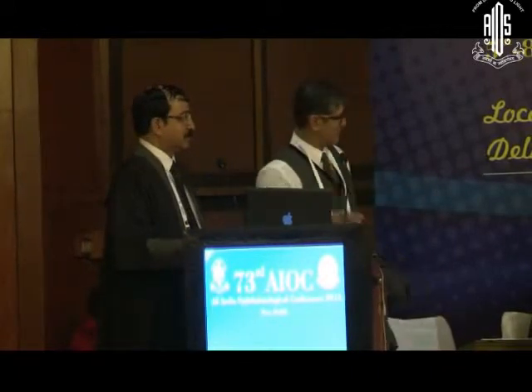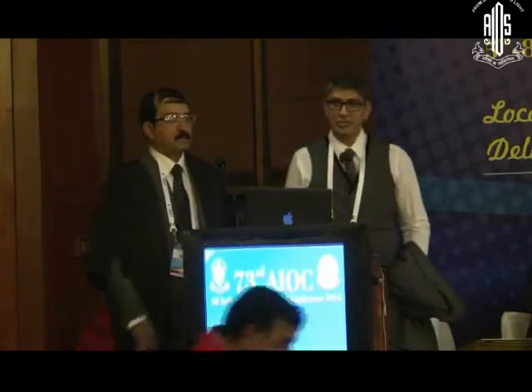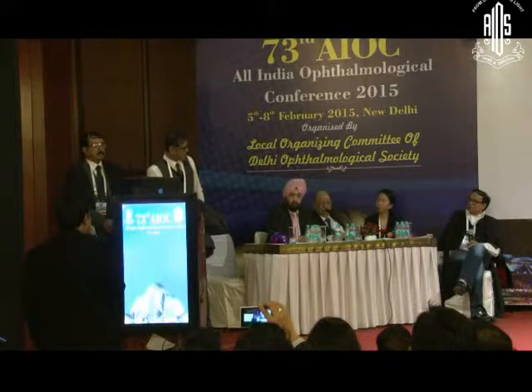Dr. Sri Ganesh, what was the preoperative refraction? It was plus 12 diopters. He was highly hyperopic, a young patient with good accommodation, so I didn't want to do a refractive lensectomy in the first position. And he had a good ACD, so I went in for a hyperopic ICL, and the patient did very well. He was very happy with the surgery, had uncorrected 6/12 vision.